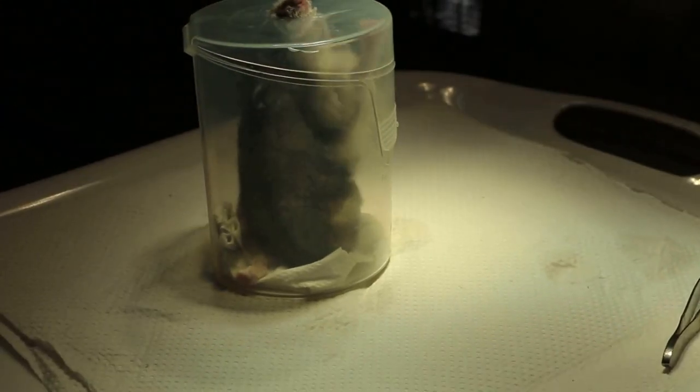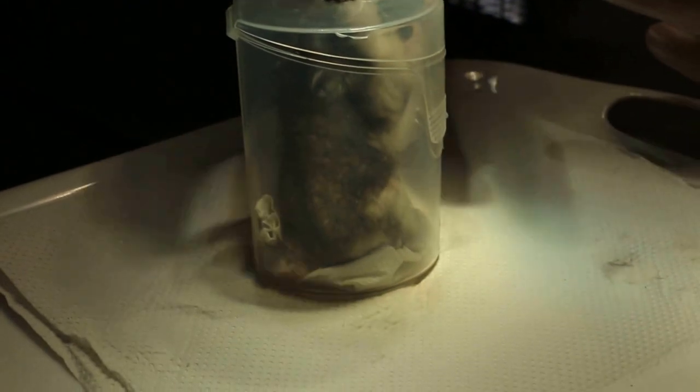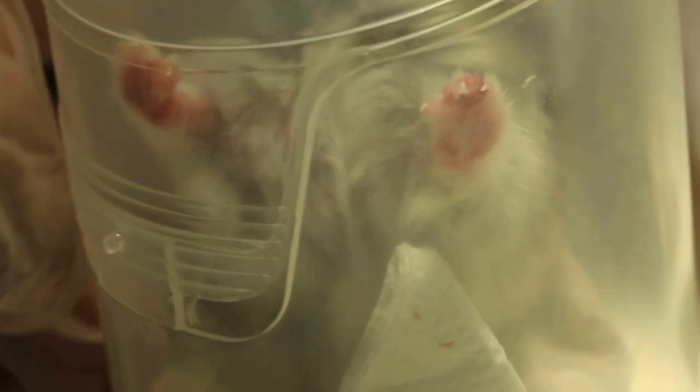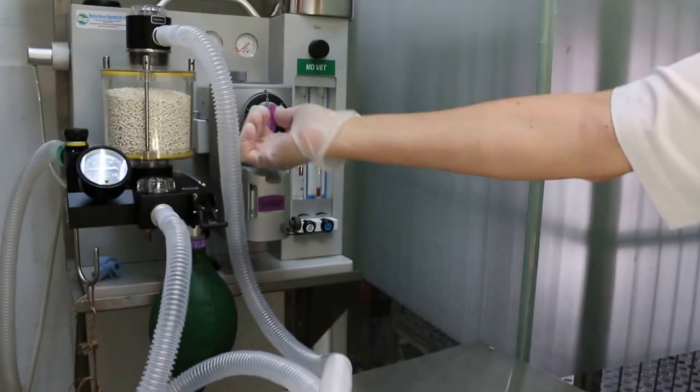Okay, today is April 14, 2016. This female hamster, 8 months old, has a wart in the right fore, no, left fore, which I think you can see roughly from here. So it's been given anti-inflammatory for 1 week, and now the swelling is not so inflamed.